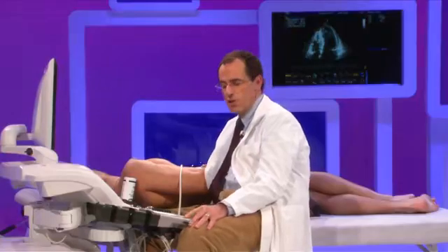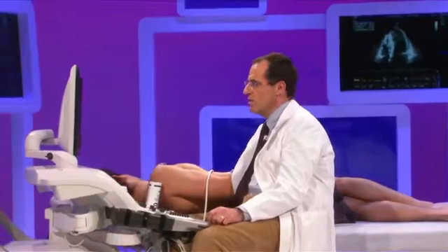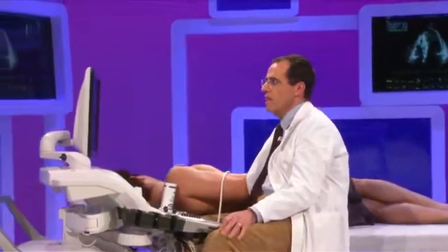Very important, but I didn't do it in this patient because the obstruction was very high, is to assess in non-obstructive patients at rest also the indexed stroke volume, because most of these patients, as they have very small cavities, they may have, and they often have, very high ejection fraction but very low stroke volumes.